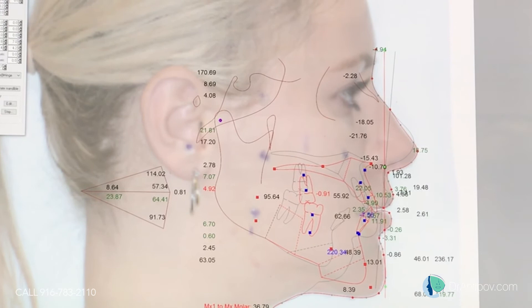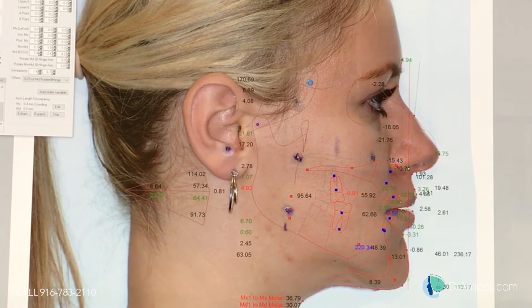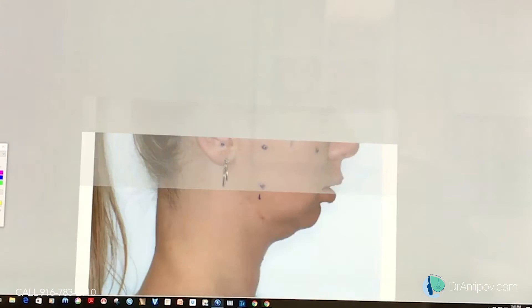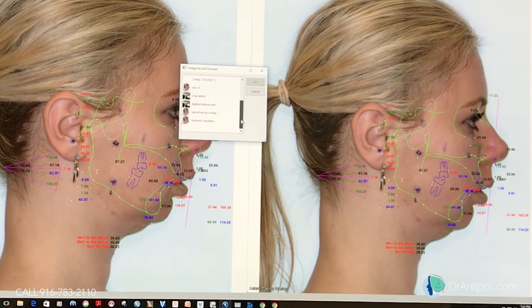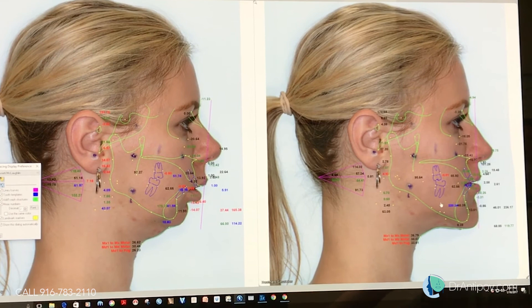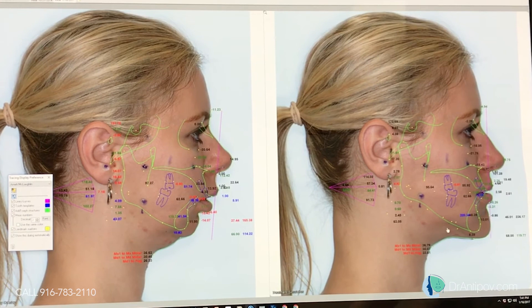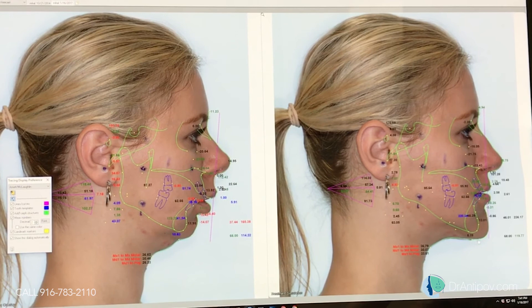If we click out of this, it's going to show our approximate profile change we're going to address. So that's approximately the face we're going to go for - a large advancement, about 20mm at Pogonium, a lot of counterclockwise rotation of the occlusal plane, and approximately 5mm advancement and bone grafting at the incisal edge. And then the nose lengthening.